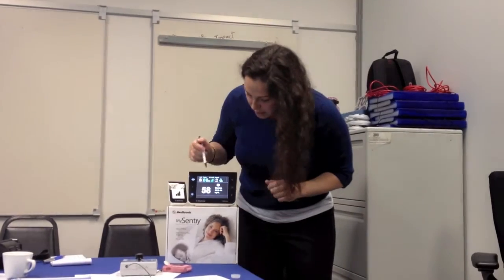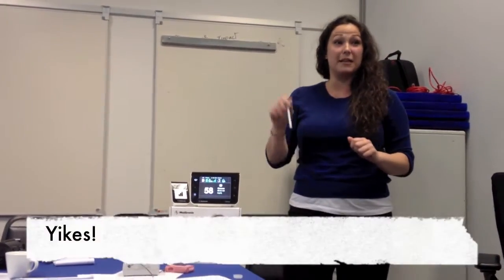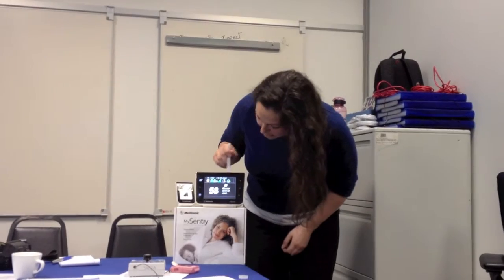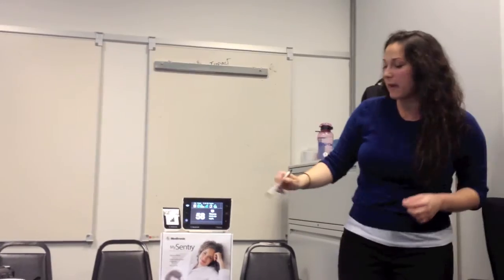Is everyone good so far? Mm-hmm. Okay, definitely. So as you can see, this is showing a 58 right now, and it's showing a double down arrow. So it's showing that this person is dropping pretty quickly, and we should get an alarm here pretty soon. So now we'll go over to the sensor information that it's going to show. This first one will show the hours until your next calibration, and that also goes in colors of green, yellow, and red. So it'll say, okay, we have 4 hours until that next sensor calibration is due.